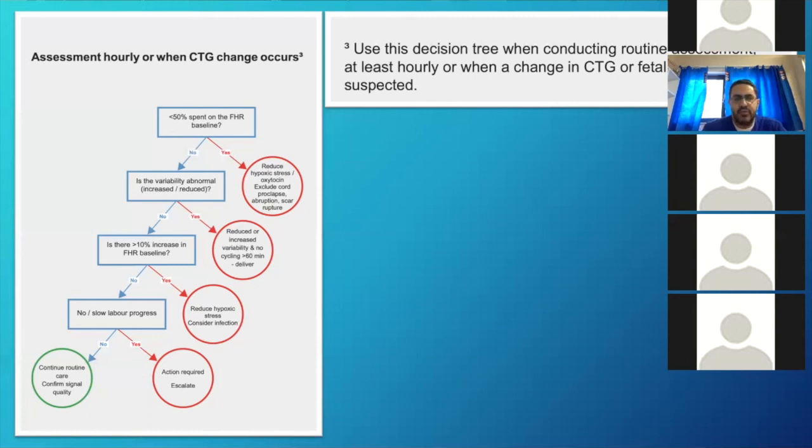You don't have to have 100% for STAN to be appropriate. You need at least one cross per minute. And you should not be getting gaps of more than 4 minutes apart. If you're getting more than 4 minutes apart, that means that STAN might not be reliable.